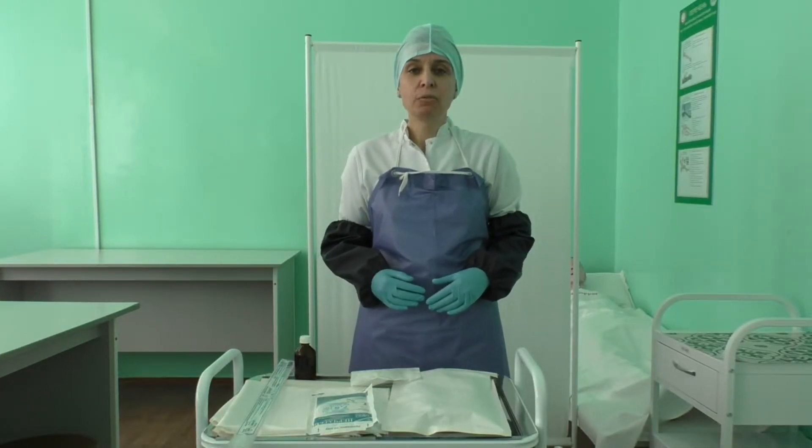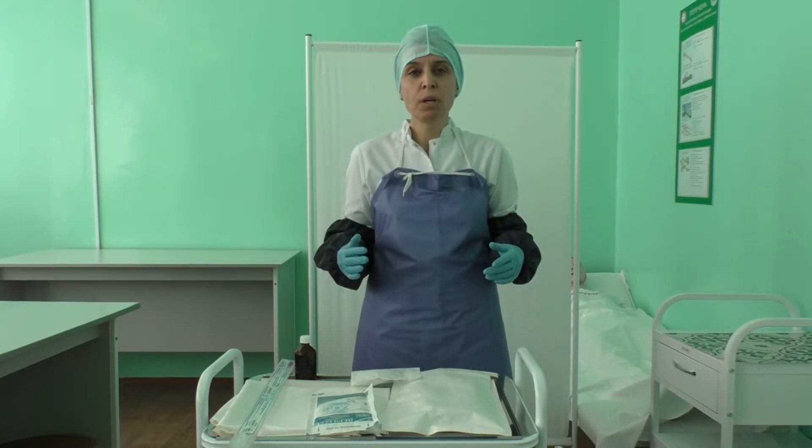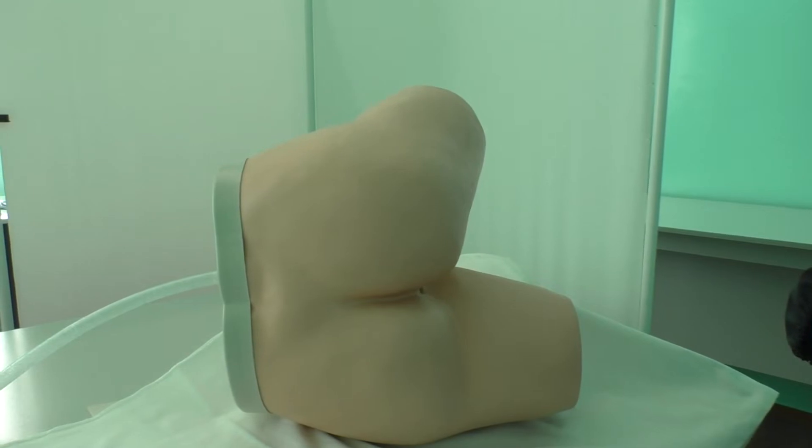Perform hand hygiene and apply PPE: lab coat, apron, medical mask, plastic sleeves, and non-sterile medical gloves.